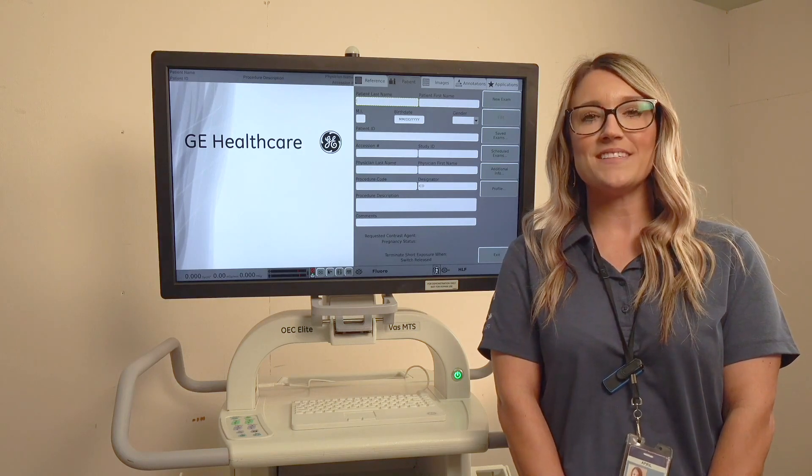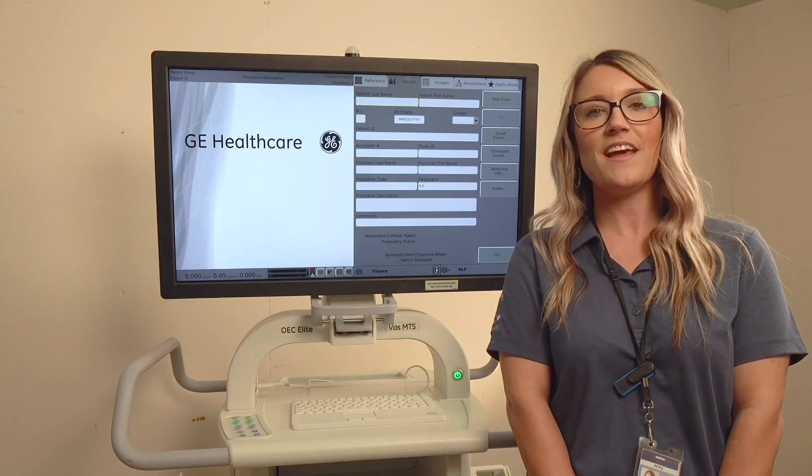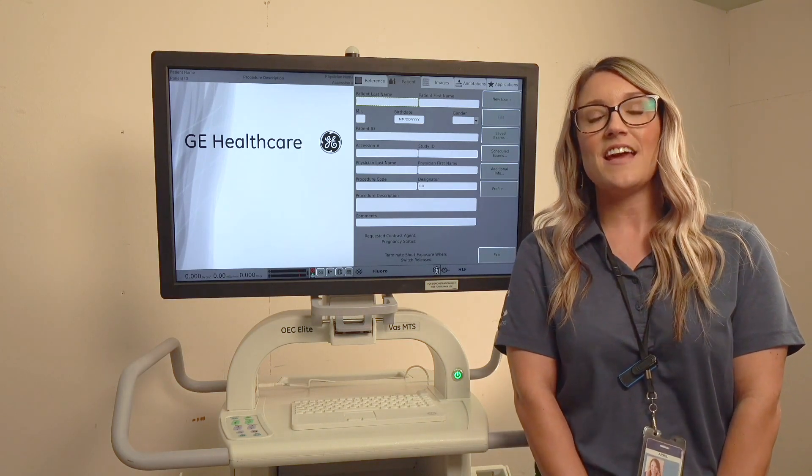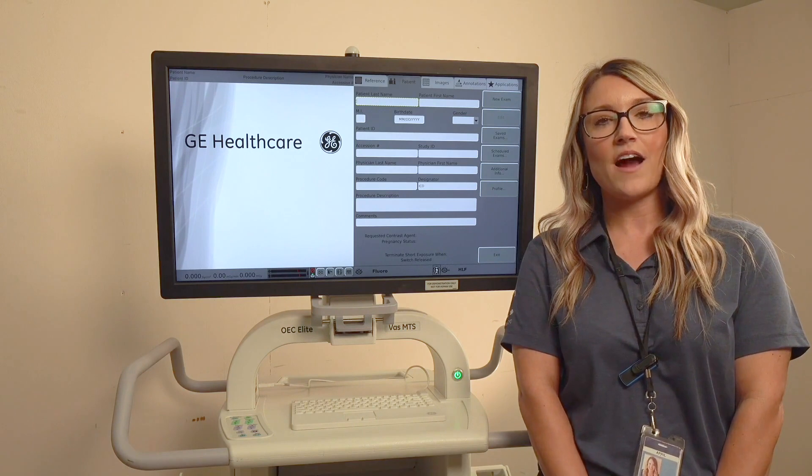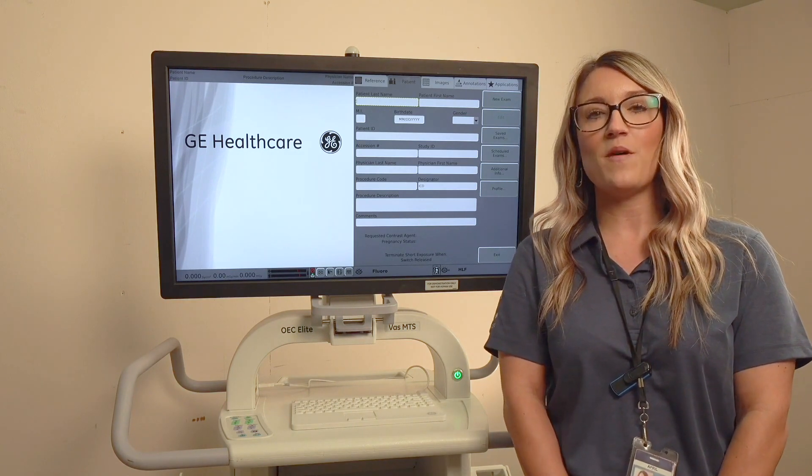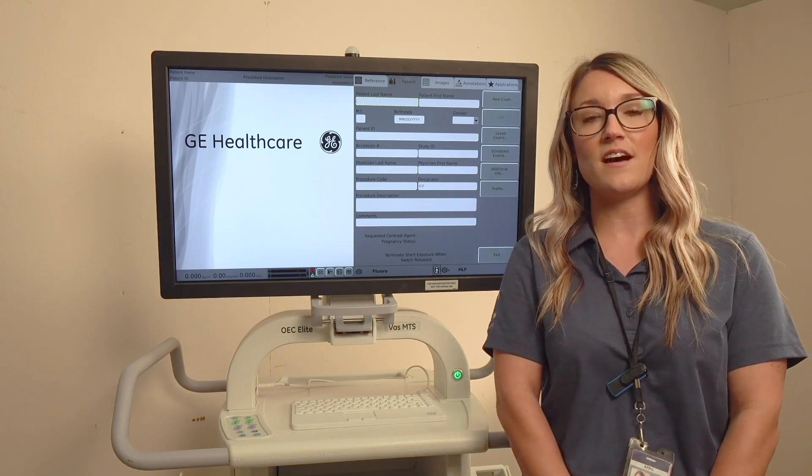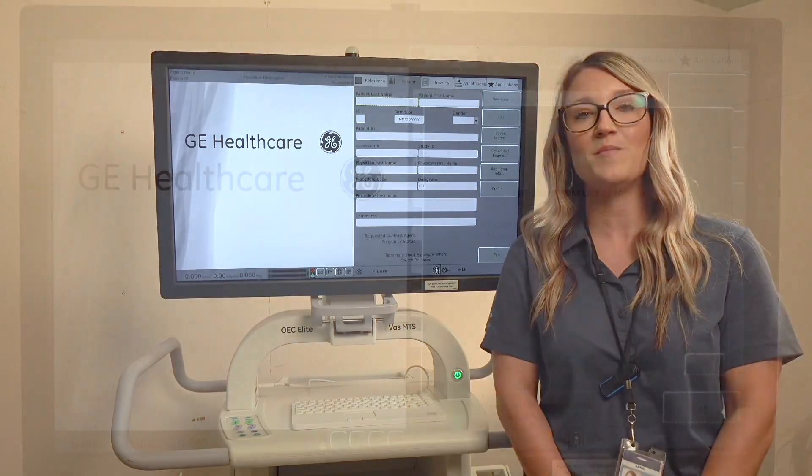Hi, my name is April Beasley. I'm a clinical imaging specialist with GE Healthcare. Today I'm going to go over how to start a new exam on a patient that was previously done on our system.